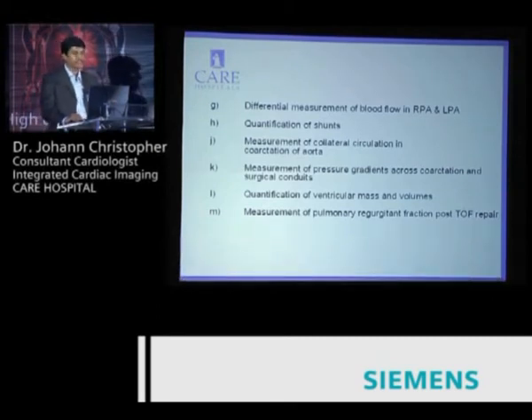Quantification of shunts we've started doing, and this is a very good non-invasive way. I'll just show you an example. Most of these children had to go for CATs, which is a 30 to 40 minute procedure. Patient is almost hypothermic in the cath lab, and we can do that safely in the MR, much shorter time with just a venous injection.